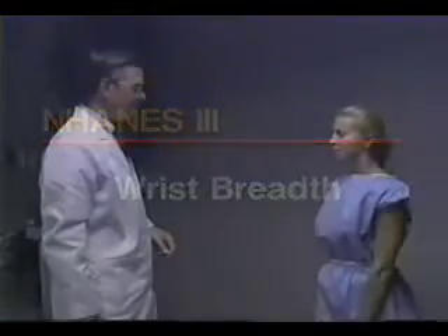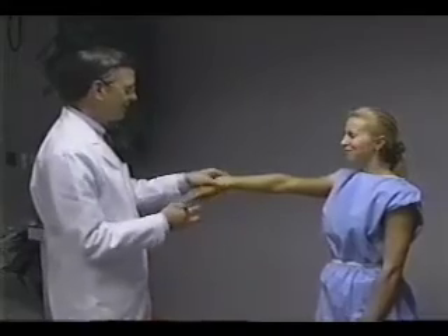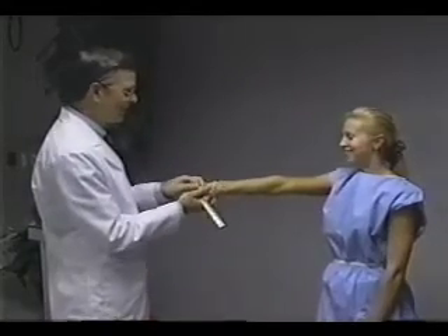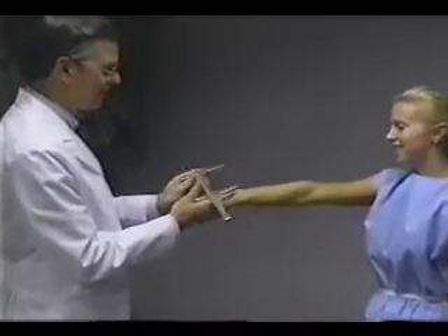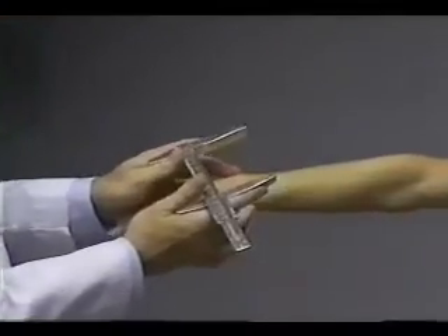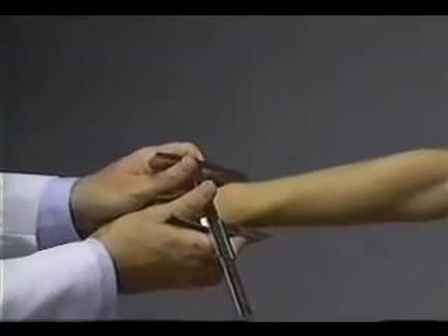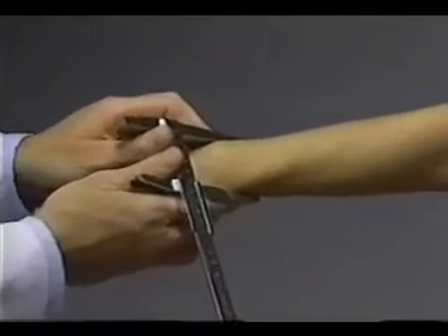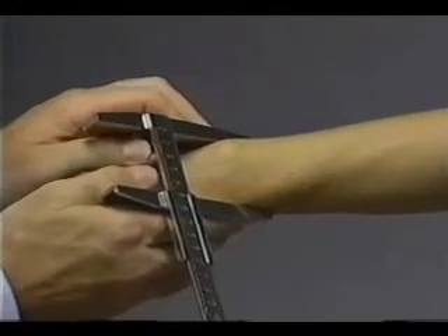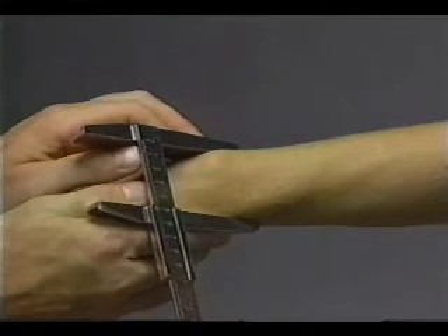Wrist breadth is measured with the subject standing. The subject extends the right arm directly to the front with the palm of the hand down. The small sliding caliper is held between the thumb and index finger of each hand. The technician palpates the most prominent aspects of the styloid processes of the ulna and radius with the middle fingers. The caliper blades are placed on these landmarks and firm pressure is applied to compress the soft tissues. The wrist breadth is recorded to the nearest millimeter.